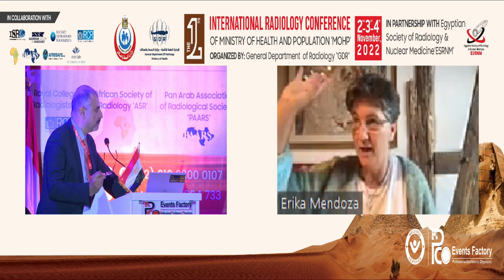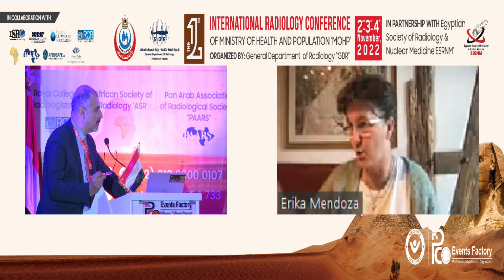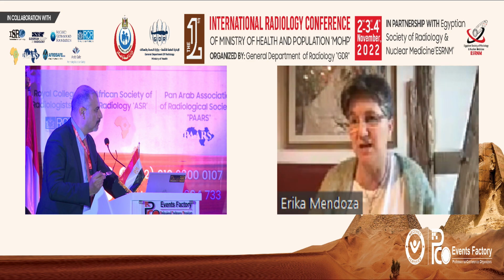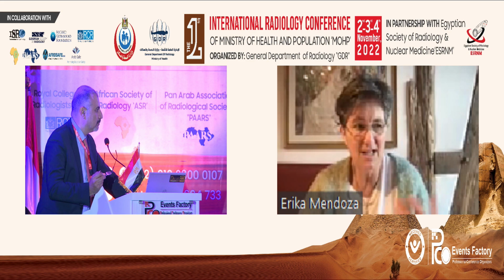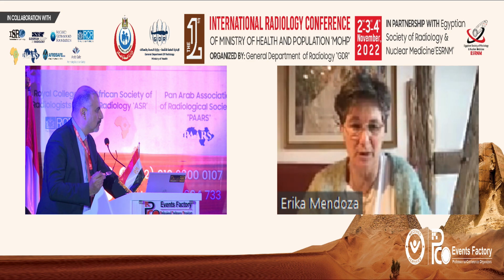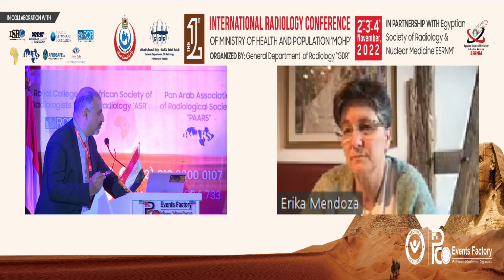So if you're sure it doesn't come from the groin, the saphenous vein is gone, and there is no perforator, you have these lots of tiny tributaries, and nobody will treat that surgically. So nobody needs to know the exact source. You have to foam it for your own solutions. You have to foam it.